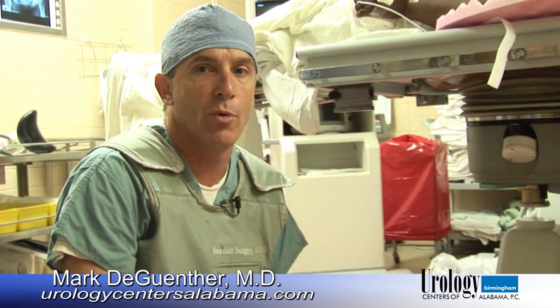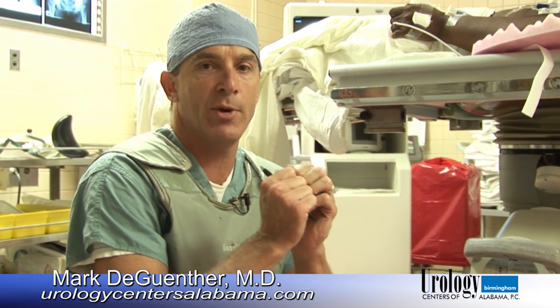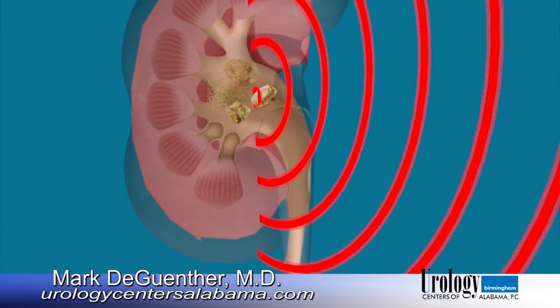The shock wave is generated by, the easiest way to think of it, a giant spark plug underwater. And as a great amount of power is transferred from one side of the spark plug to the other, it creates a huge gas bubble where there's a rapid expansion of the water into gas, which happens whenever you heat water. That is transferred out in all directions, but it's caught by a parabolic dish under it, kind of like a satellite dish, that then focuses that shock wave back up towards the stone. And that shock wave then breaks the stone up into fragments.